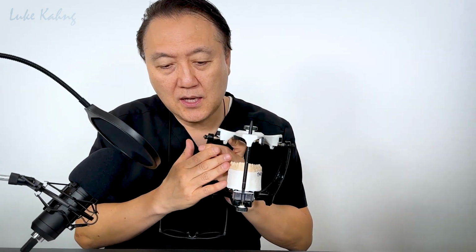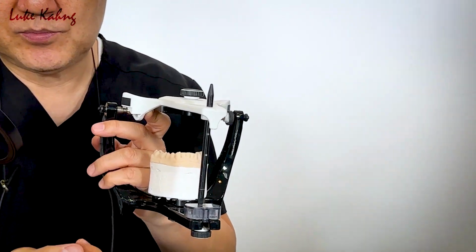After that, we mount, and then we print the model digitally and then prep the cases, and then I can give you a little bit more on the design, what I do, how I approach it. I always recommend that the doctor give me the face photo, smile photo, retracted photo, side photo, and a little more detail is always welcome. Then I can see the patient's budget, and I can see what the patient expects, from class 3 and class 1, class 2 and class 1, and then try to make it as nice as possible. Some people need bulk out, some people don't. So there are many things we have to narrow down.